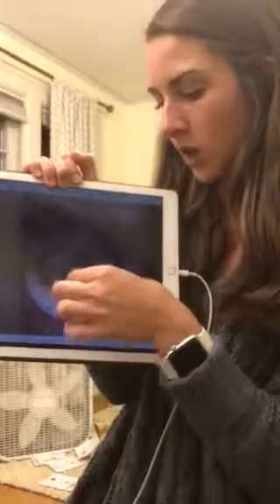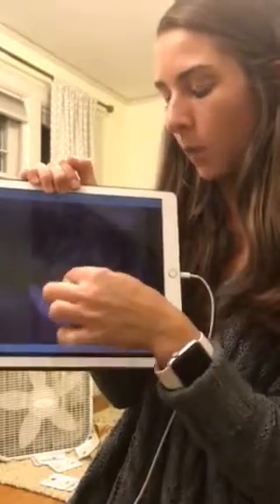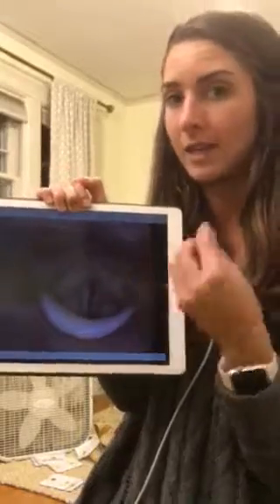Sometimes people get lumps on either side, on either vocal fold. They will get one lump on each vocal fold that looks identical, and these are called vocal fold nodules.